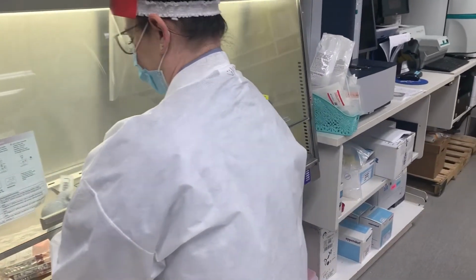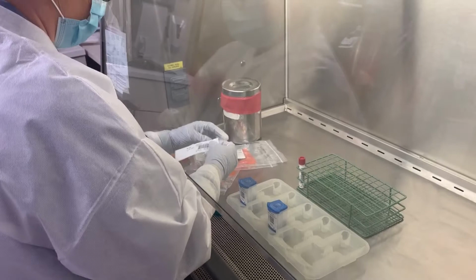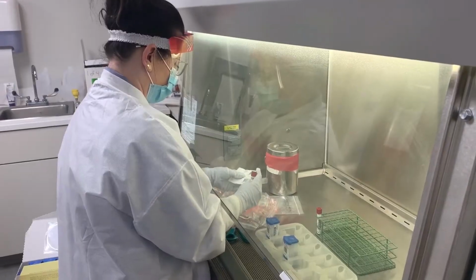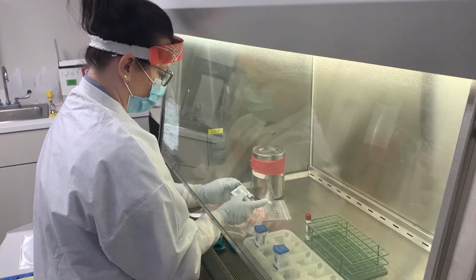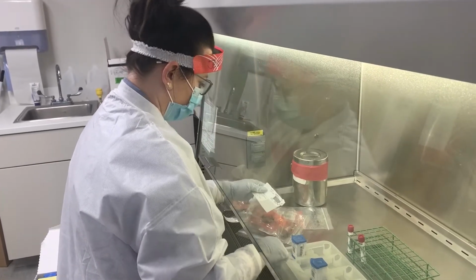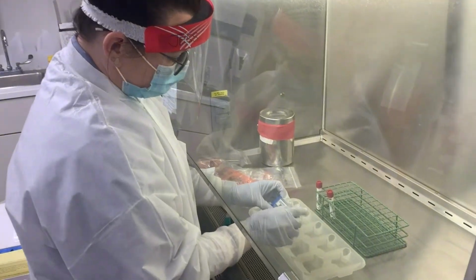Now what Jess is doing is she's preparing all of her labels to fit properly onto the outside of the cartridge. After she's done doing that, she will place the label on the cartridge to make sure they're all properly identified. Next, Jess will take her label and match it up with her specimen to make sure two patient identifiers match for positive identification. All of the samples are a nasopharyngeal swab placed down in viral transport media to preserve the virus.